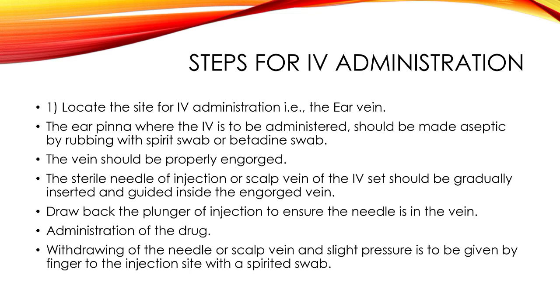Then administration of the drug is to be done. And lastly, after withdrawing the needle or scalp vein, slight pressure is to be given by finger to the injection site with a spirit swab after giving the intravenous medication. This can be easily understood by a video, so let's just head over to that.